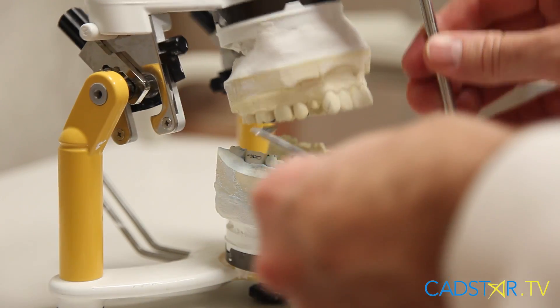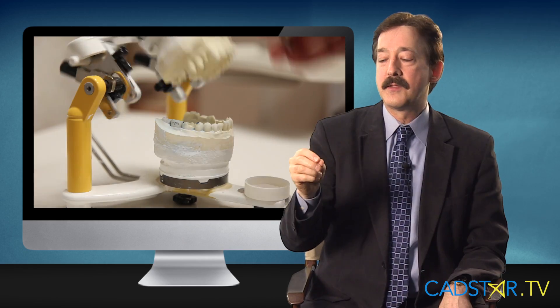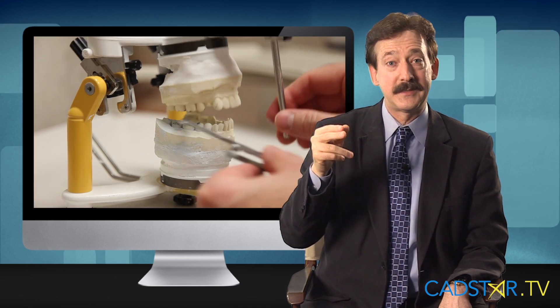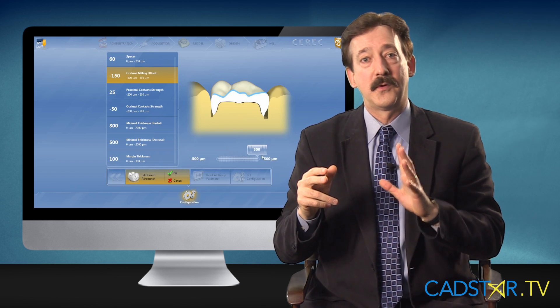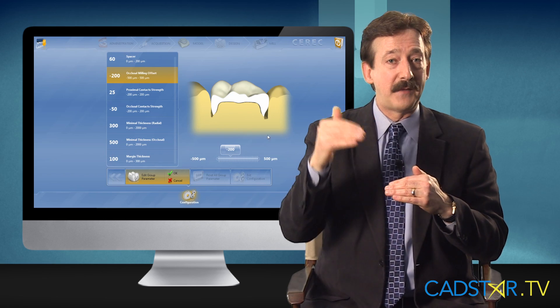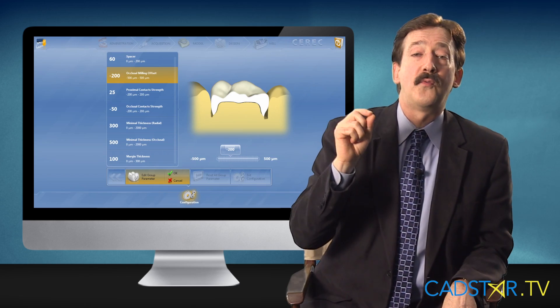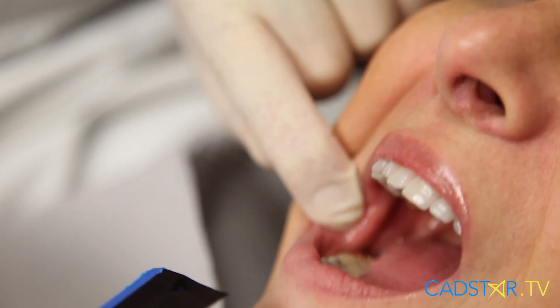Here's a question: assuming it's not a second molar, would you rather have a restoration high or out of contact? Remember, a high restoration that we're adjusting in is going to compress the periodontal ligament. I find that my occlusion is pretty close to shim stock — that's 8 microns — using negative 150 for occlusal offset and negative 50 for occlusal contact strength in the Bluecam. For Omnicam I just shift occlusal offset up to negative 200. The Trofil articulating paper is also 8 microns thick and marks ceramics very well.